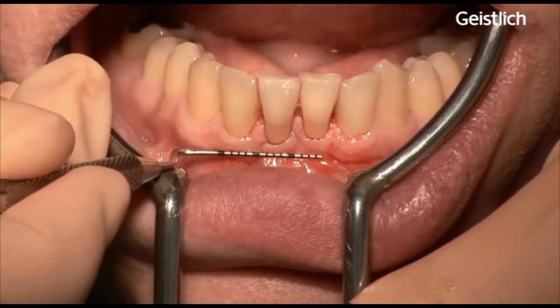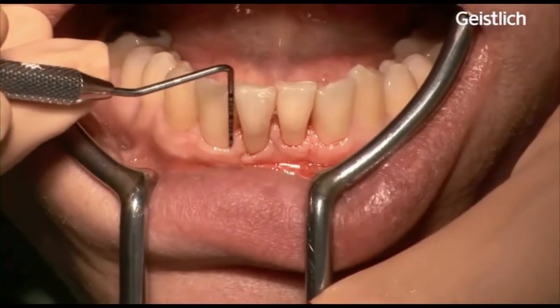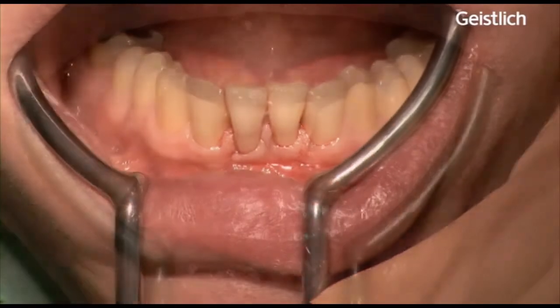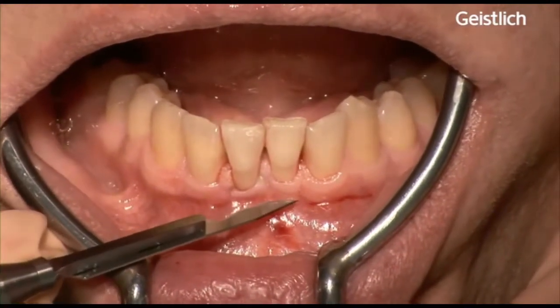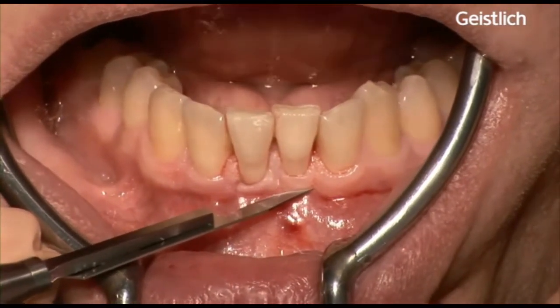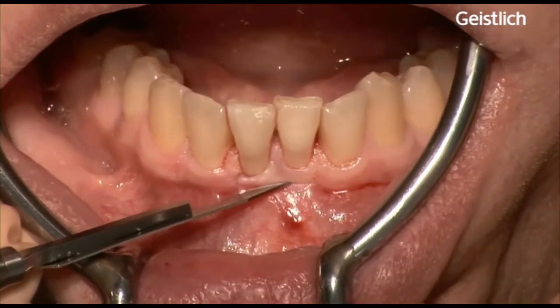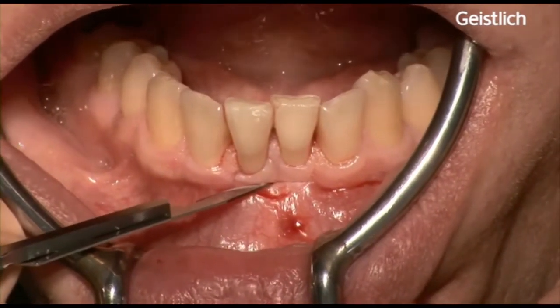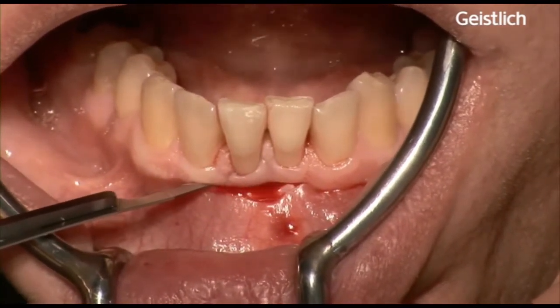The surgery starts with a horizontal incision just beyond the mucogingival junction. It is important that a minimal band of keratinized tissue is present in the treated side or in the surrounding tissues.